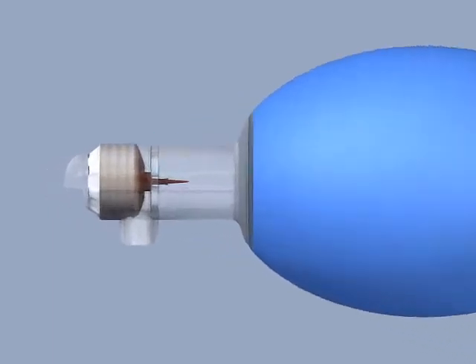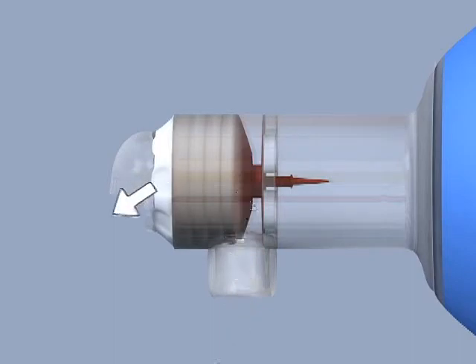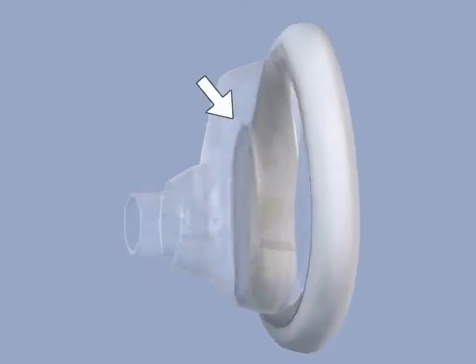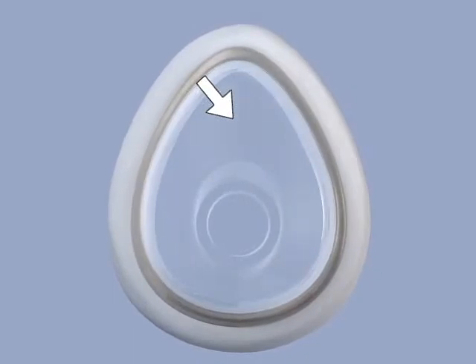Note that when the bag is squeezed, the valves allow oxygen to flow from the device to the patient. Exhaled gases are prevented from re-entering the bag and are instead diverted through an exhalation port. The mask has three main components: a round connector that attaches to the bag, a hard shell that is usually clear to allow for constant visualization of the airway, and a circumferential air-filled collar, which provides an airtight seal when placed against the patient's face.